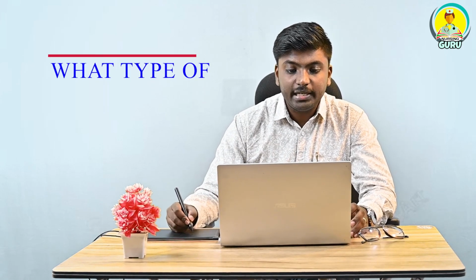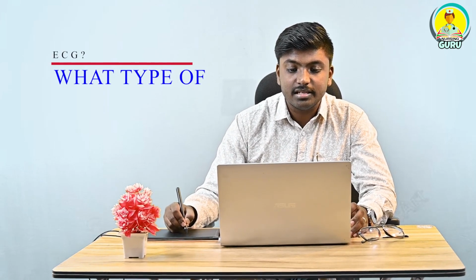To interpret the ECG, you should know a few things. What you should know is what type of ECG it is, whether it is a 12 lead ECG. Okay, so that you should know. And second is rate, rhythm, and what axis it has been taken on. Okay, so all these we'll be discussing in the next upcoming sessions.